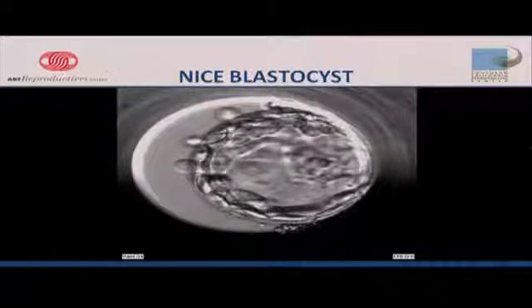Now that was sped up really fast compared to what you were showing them. And there are reasons that we put it together real fast like that. And any patient that actually gets pregnant, we give them baby's first video of that exact type of thing, because you can't get a video earlier than this. I mean, there's a sperm and there's an egg, and well, you can't do anything there. And after that, you can get this. So we give this away as a nice little treat when they get pregnant, so that they have a very early baby video. But that's what a nice one looks like.